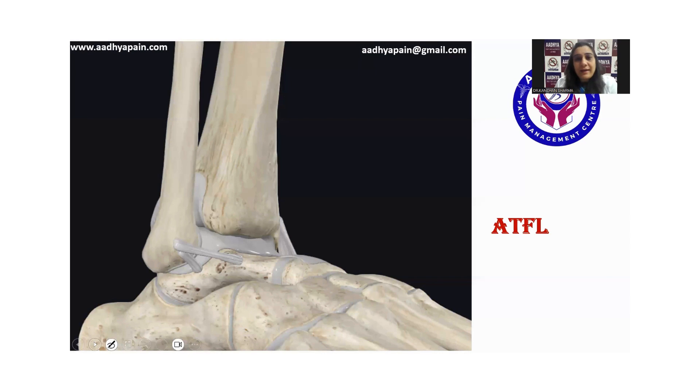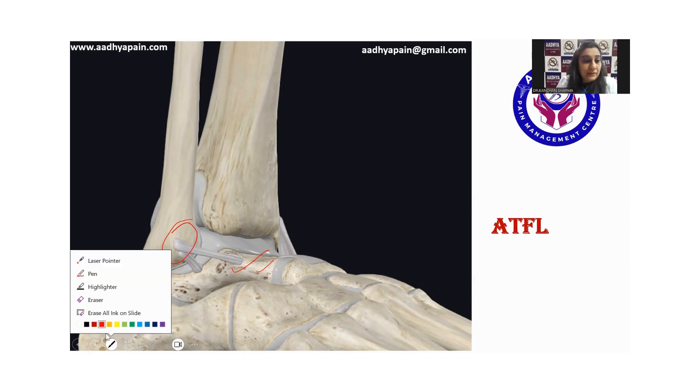Let us have a look at its anatomy. This ligament runs from the lateral malleolus anteromedially to get inserted on the talus. It can have a single band, a double band, or even three bands according to the literature. This ligament limits the anterior displacement of the talus and plantar flexion, and it is the most commonly injured ligament in ankle ligamentous injuries.